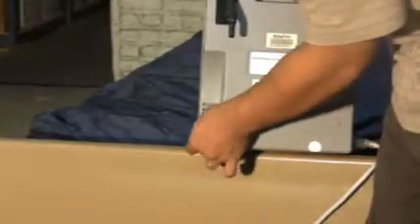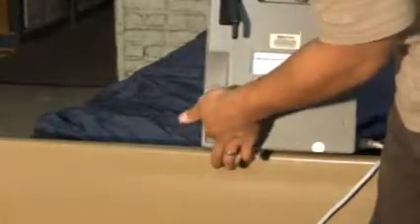Your filter should be checked twice a week recommended, once a week for sure. Please remember, do not operate your air unit if the filter is not in place.